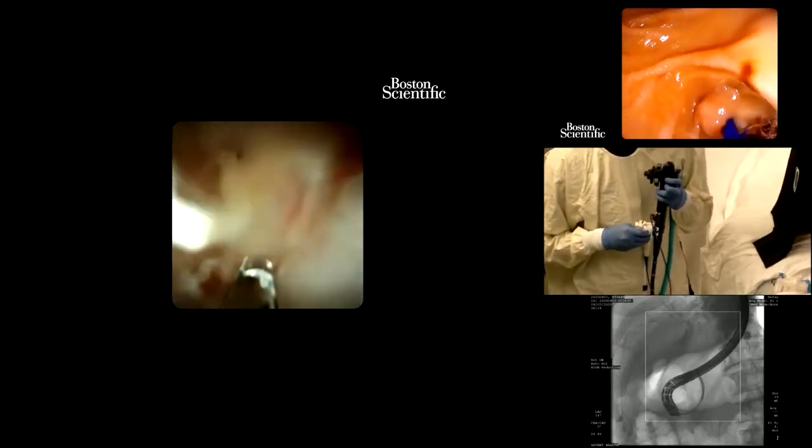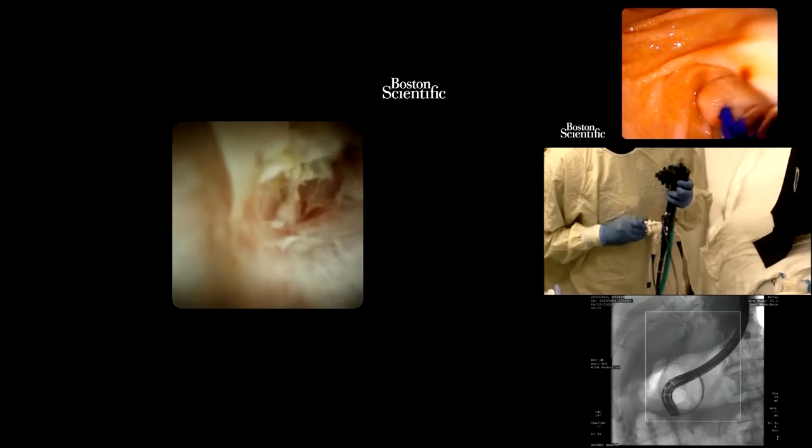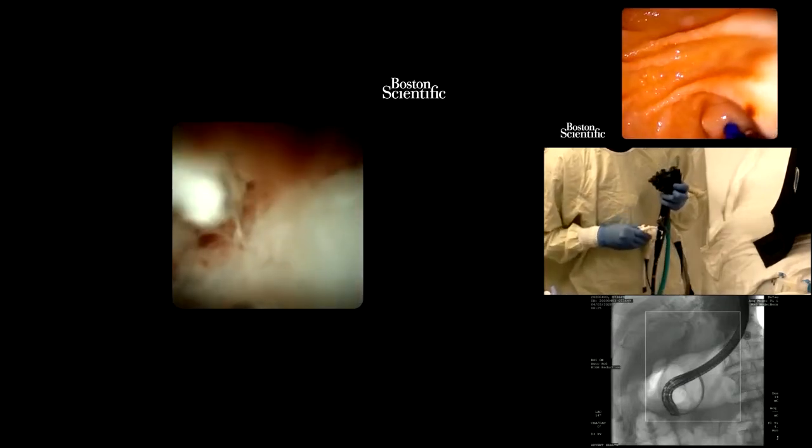So what makes you think that's more of a malignant stricture than a benign stricture, Dr. Varadarajulu? One, we already know from prior biopsies that this is a dysplastic lesion, so we already have some degree of history on this. The second is the vascularity of this lesion. You can see that despite this being stented for a while, there are some nice frondy projections. And if I advance myself even a little further, I can see that this is an infiltrative mass with vascularity around it. So to me, this is more than likely a malignant mass. This is not an inflammatory mass.